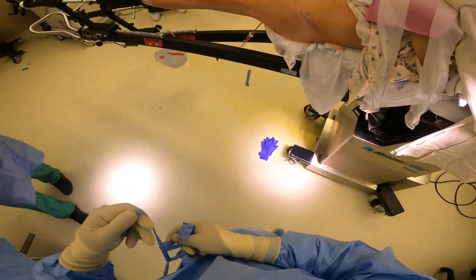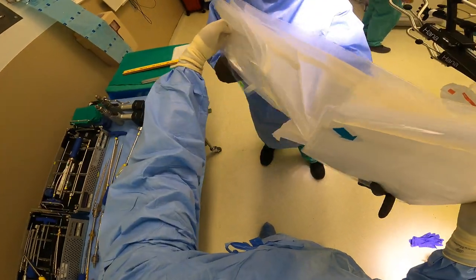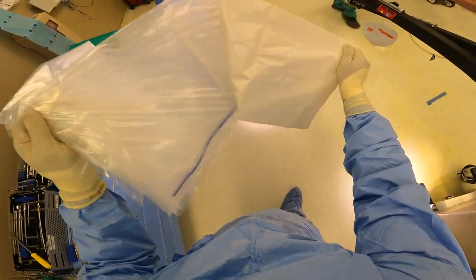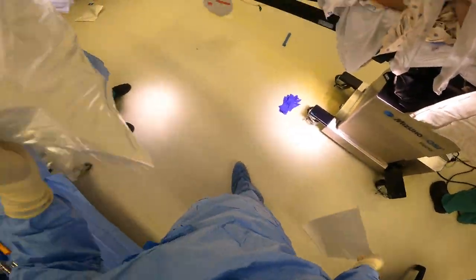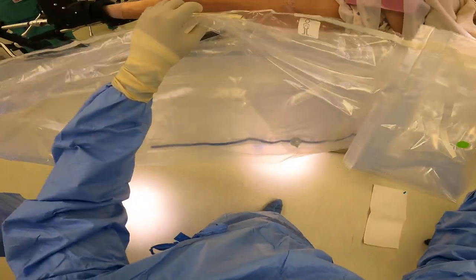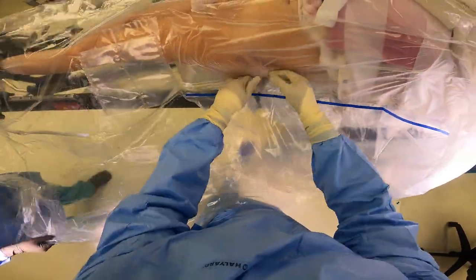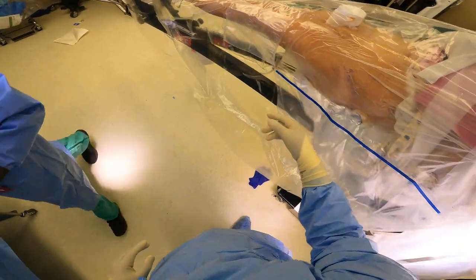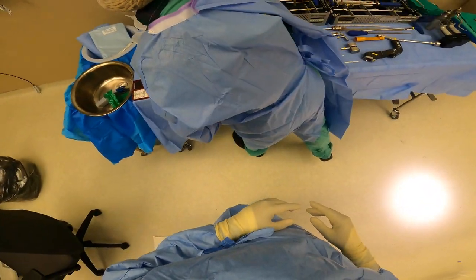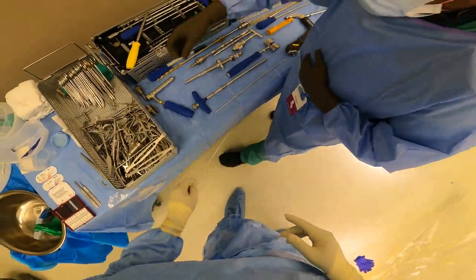We're going to get gowned and gloved up here. I use this drape here — this is called a shower curtain. It's quick and really simple to use; it helps with draping out the whole entire area in a really efficient manner. I'm going to verify reduction of the fracture first, so I bring x-ray in just to reconfirm that we have a good reduction. We were actually pulling on the patient's leg and also providing some internal rotation due to the deforming forces from this fracture.